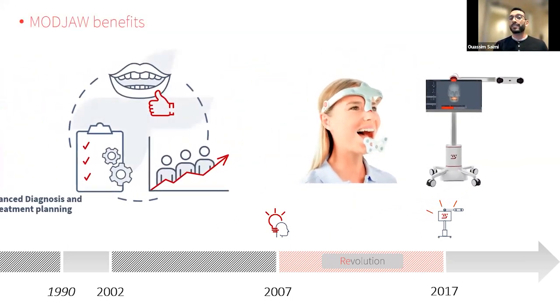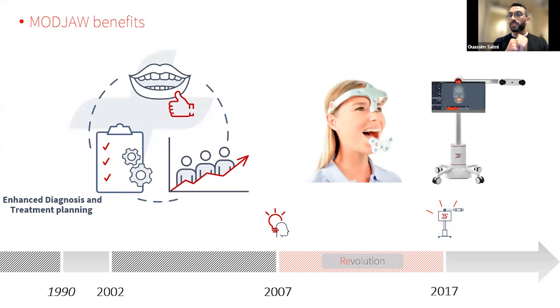And the aim of that is going to be the same as what we said before, but it's more clinically applicable, because as I said, it's the continuity of the daily work. You scan, you have static, you put them inside Modjaw, you have dynamic. And using all this dynamic, you'll be able to enhance the diagnosis and the treatment planning. You'll be able to check how the contacts are inside the mouth of the patient in the initial situation, and also in a project before putting it inside the mouth of the patient.